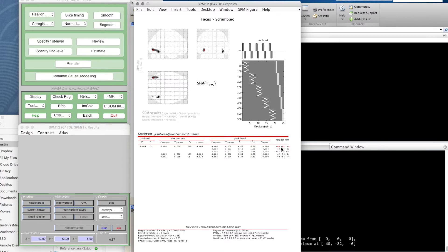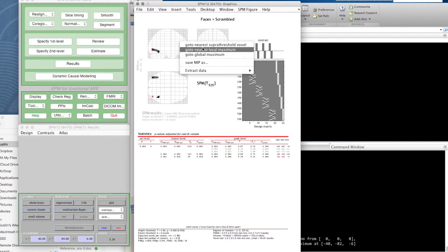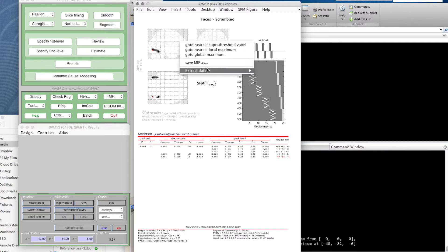I can actually click on a value in this table and you can see the little cursor jumps—it's an interactive table there. You see the options: go to nearest supra-threshold voxel, nearest local maximum, or the global maximum. You can even extract data in various ways, but we'll come to that later.